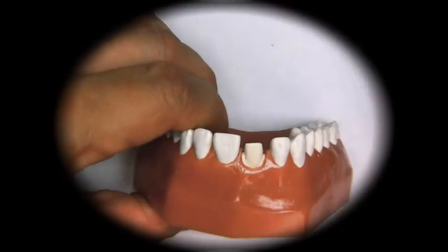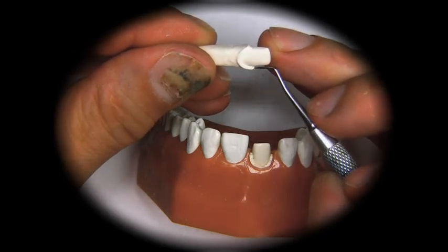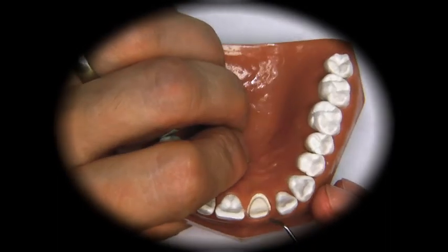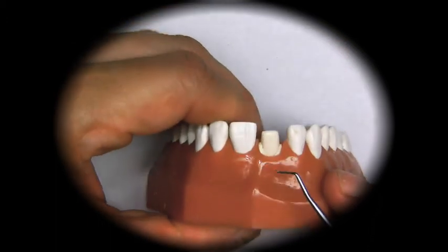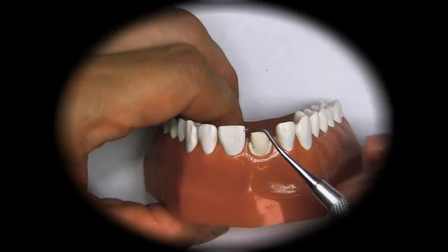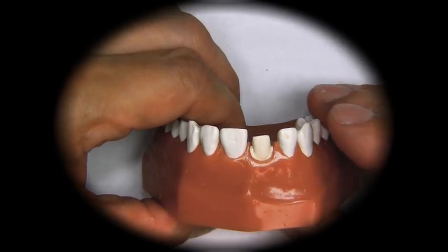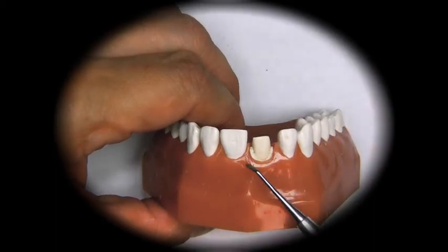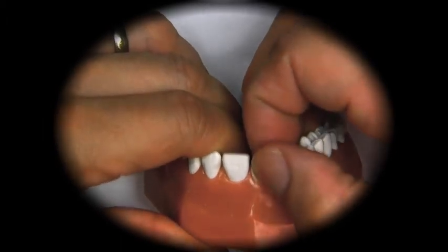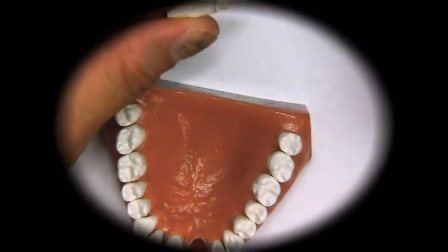When we put it back, we have to make sure that the margins are below the margins of the model. If our margins are not at the bottom, so if we look at it straight from the top, we can't see them. That is so, when we make the crown, we do not see the margins when we look at the patient. The crown will look like it's coming out of the gum, and this is the representation of the gum.